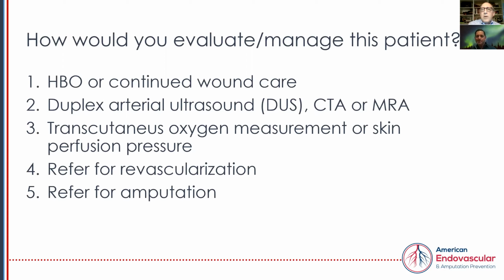Really, and I don't want to steal John's thunder, and we're going to go through each modality separately, but we have a dedicated ultrasound technologist who has been with me for several years, very dedicated. We're constantly speaking with each other regarding the findings, so I can trust his findings. And once we get a basic ultrasound exam, then we'll go from there, either going straight to an angiogram, or if we need to, get further studies.